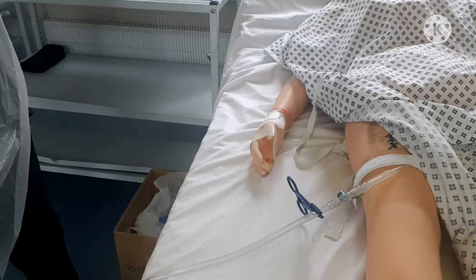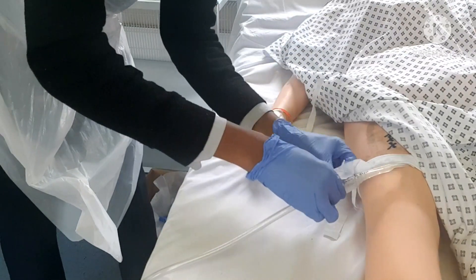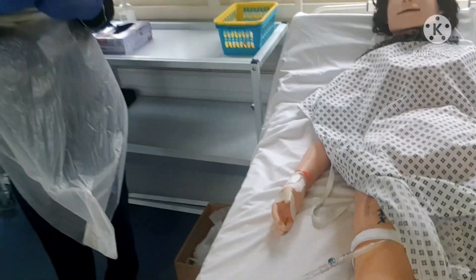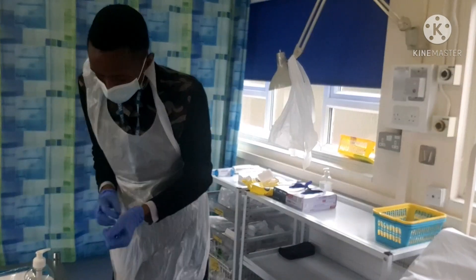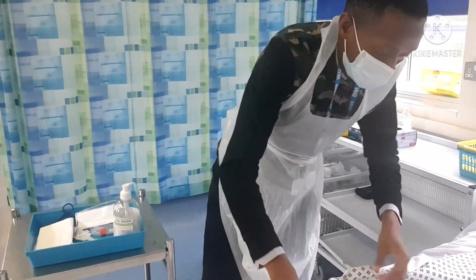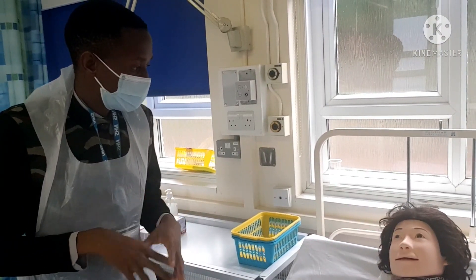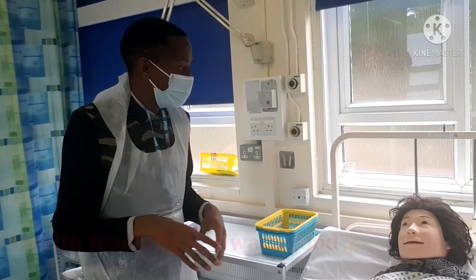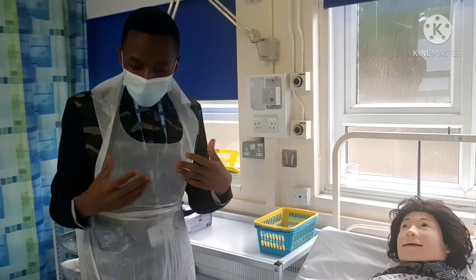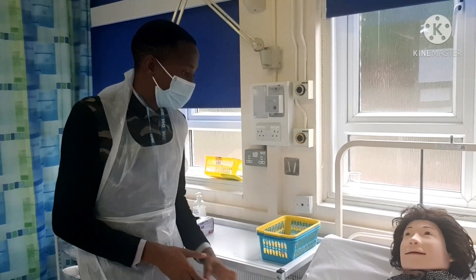I will clean the port for 30 seconds and allow it to dry for another 30 seconds. I will remove the clamp and clean it according to the manufacturer's guidelines and place it safely. I will cover my patient and then educate them on signs and symptoms of urinary tract infection, such as pain when passing urine or passing cloudy urine. I'm going to send the sample to the lab, then relay the results to the doctor who will give an individualised management plan. I will confirm if my patient is comfortable and leave them with a call bell in case they need anything.